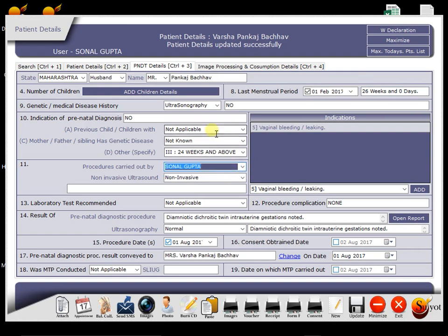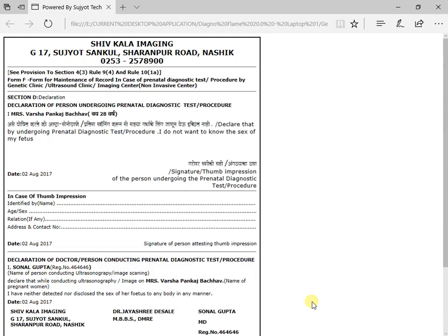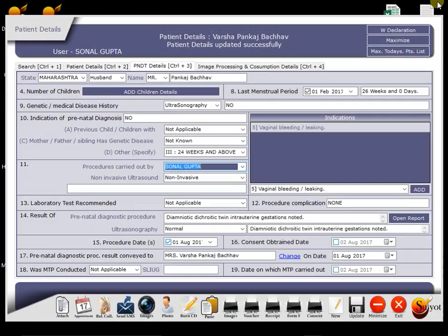Now at the bottom, there is another button to take consent printout. So this is the consent. These all things will happen at the reception counter.